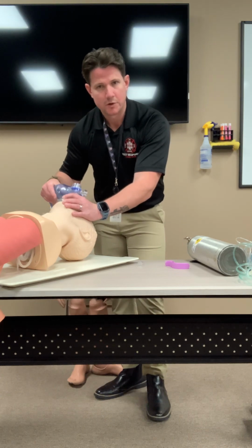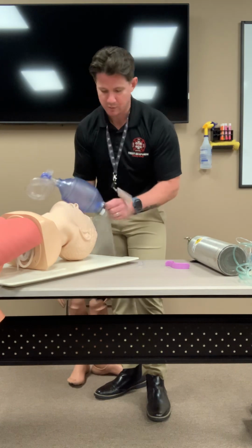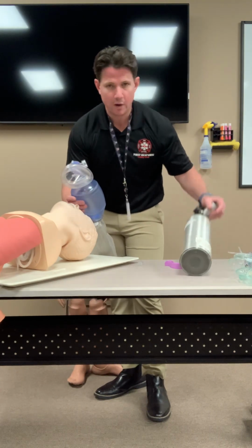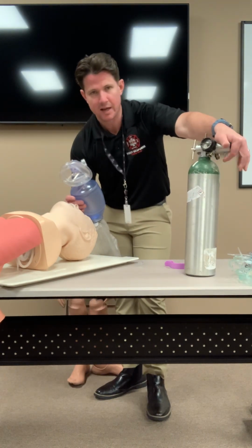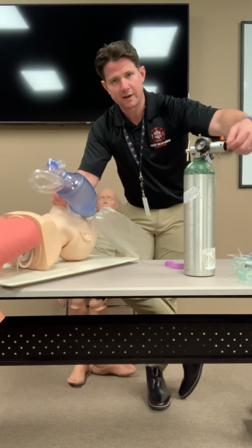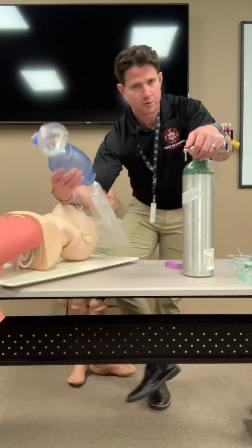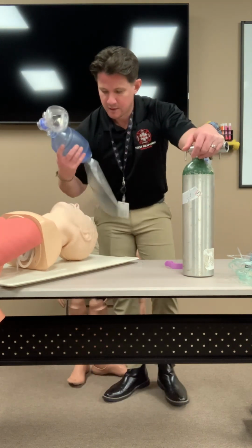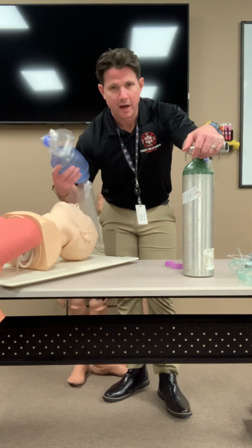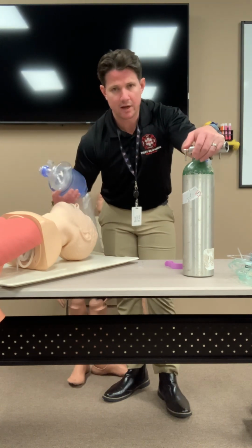So 30 seconds initially, get him some airflow, then let's verbalize, let's make sure we get our oxygen tubing connected to our oxygen tank, again, at the same spot as everything else, right? And then I'm gonna set my flow again, 15 to 25 liters with this. This is delivering 100% oxygen, all right? So that's what you wanna tell your proctor, hey, I'm gonna start bagging on high flow oxygen at 15 to 25 liters a minute, giving 100% oxygen, right?